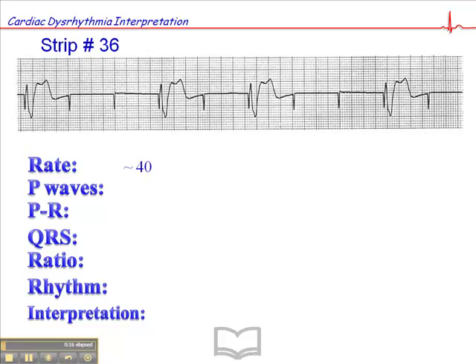The heart rate is really based on the captured beats. So here we have a wide QRS, and then another one, and then another one, and then another one way over here. So we have four captured beats in about a six-second strip — it might be a little longer. Multiply that by 10, we've got a heart rate of about 40. So now we have a bradycardic rhythm, and this is a bit of a problem.